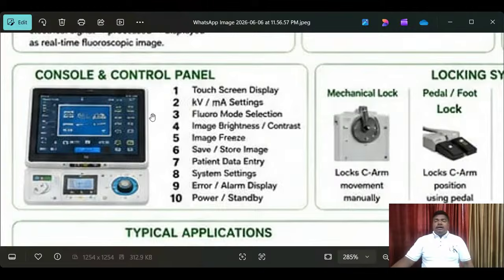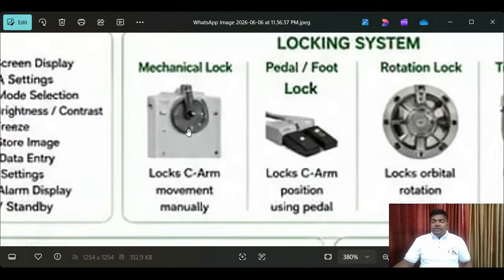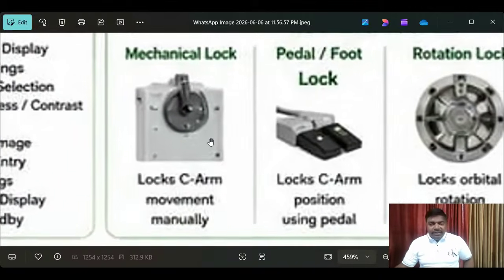This is the complete information of the CM. Okay, so in multiple ways I have explained. I hope it is very useful in your work area. Okay, right. Thank you. Next, mechanical was here. So why am I showing all these things? What was the main purpose? If you get a complaint from the hospital technician about any of these parts, that any problem has happened, then you have to get the information properly, attend instantly, and respond in the right way as a biomedical engineer. Okay, right. I hope you got it very clearly, yes.